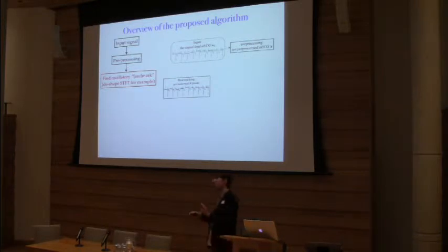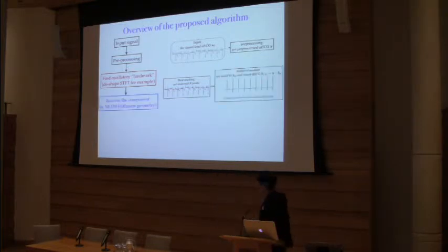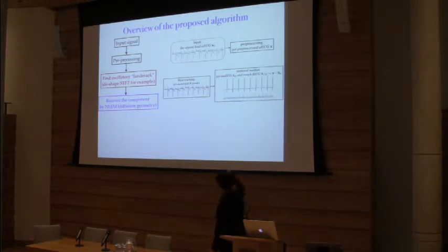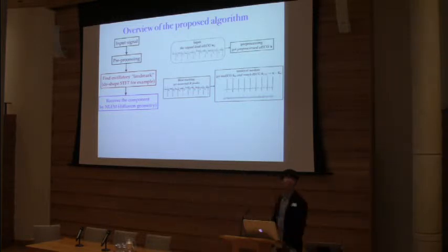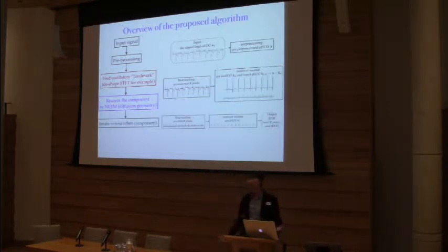Okay, there will be several challenges you will see later. For example, how can you be so sure that the R peaks are maternal or are they fetal R peaks, and so on and so forth. Fine. We find a way to determine those R peaks. The third step is we recover the component. We get the maternal ECG by running this non-local Euclidean median, which I will introduce later, or diffusion geometry. And that is the result on the right-hand side. You do the decomposition, you get this maternal ECG and the fetal ECG. Now you can iterate this, okay? You can iterate this.